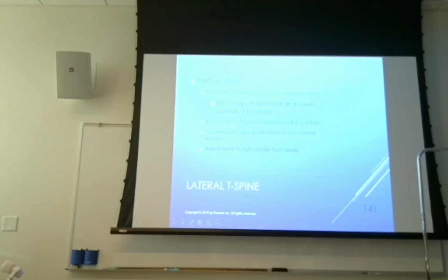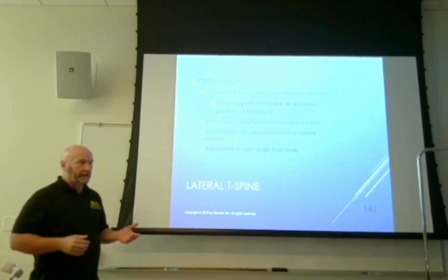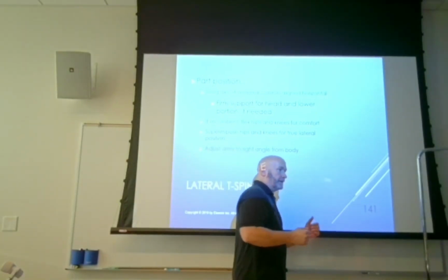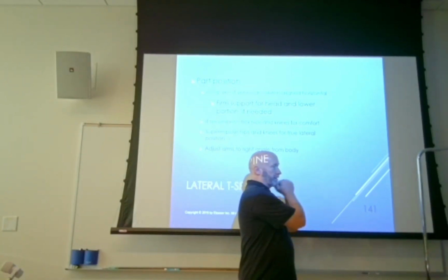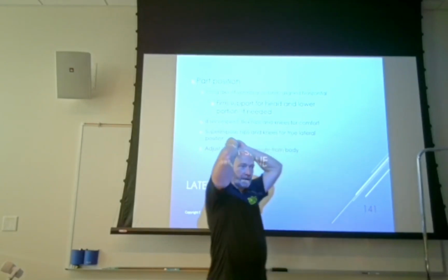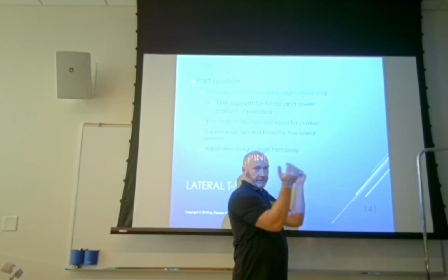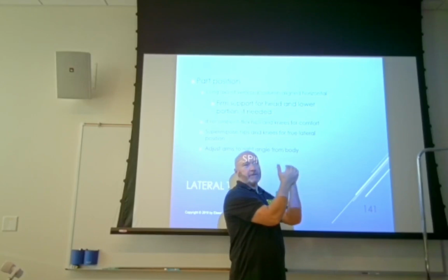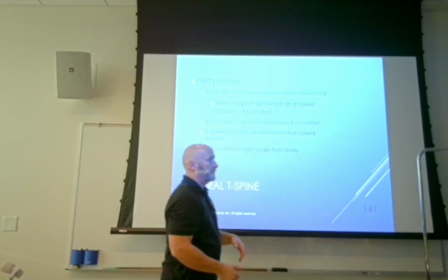What we're going to do is roll the patient up onto their side, have them bend their knees and put their knees right on top of each other. Knees and feet stacked. If the knees aren't stacked, you're going to get some rotation on the lower end, right? And then our arms, instead of having them straight up over our head like a lateral chest x-ray, are going to go straight out in front of the patient. Okay, so you can say, put your hands out in front of you like you're praying. That usually gets the point across. And knees and ankles stacked on top of each other.